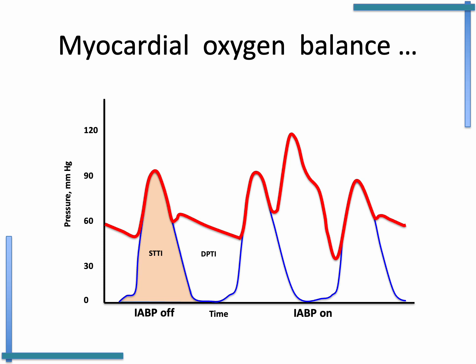And the next area that we have over here is the diastolic pressure time index, and that describes the amount of time and pressure, as it were, available for coronary perfusion and represents supply. And so we have demand and supply available to us in indexed form from this trace.